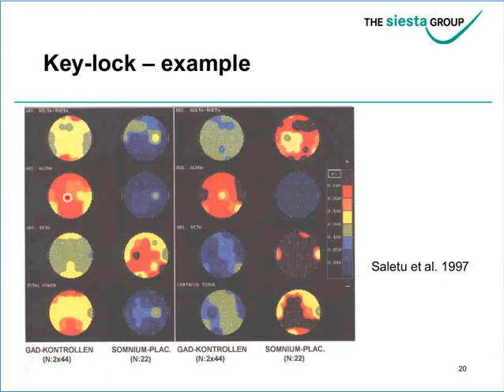In this case, you see the typical increased pattern in the alpha band and the total power, and you have the profile of a certain drug class, versus placebo, and you see wherever there are increases in the disorder, the drug counteracts with decreases in the respective bands. So this illustrates this very interesting key-lock principle.